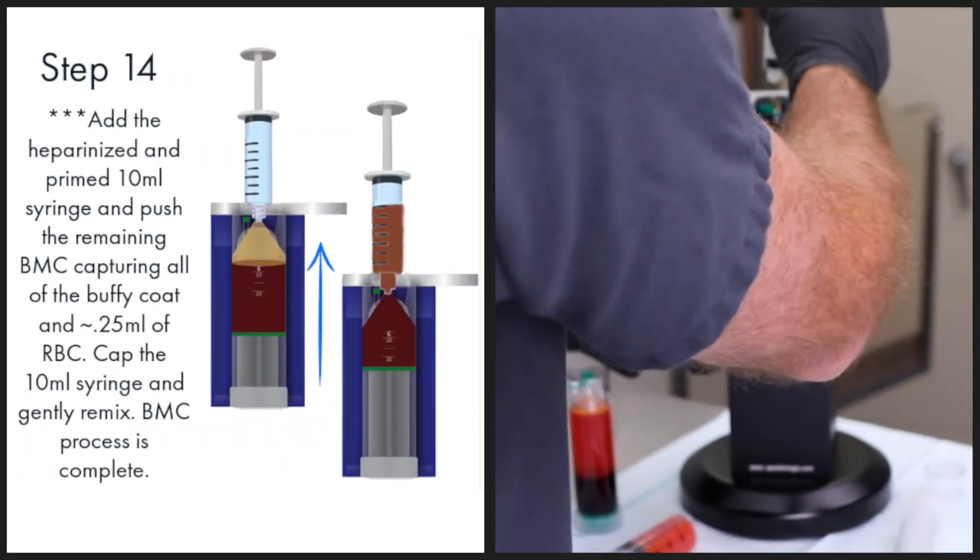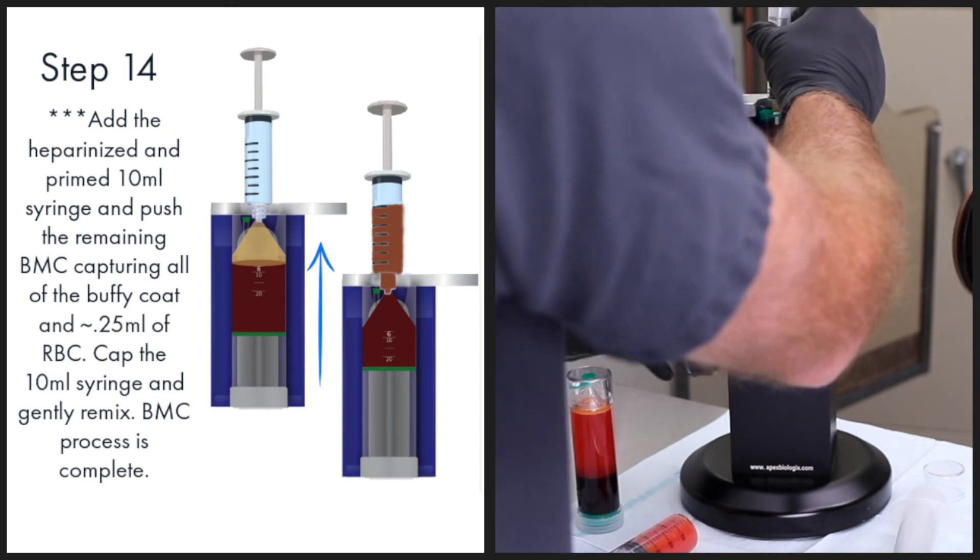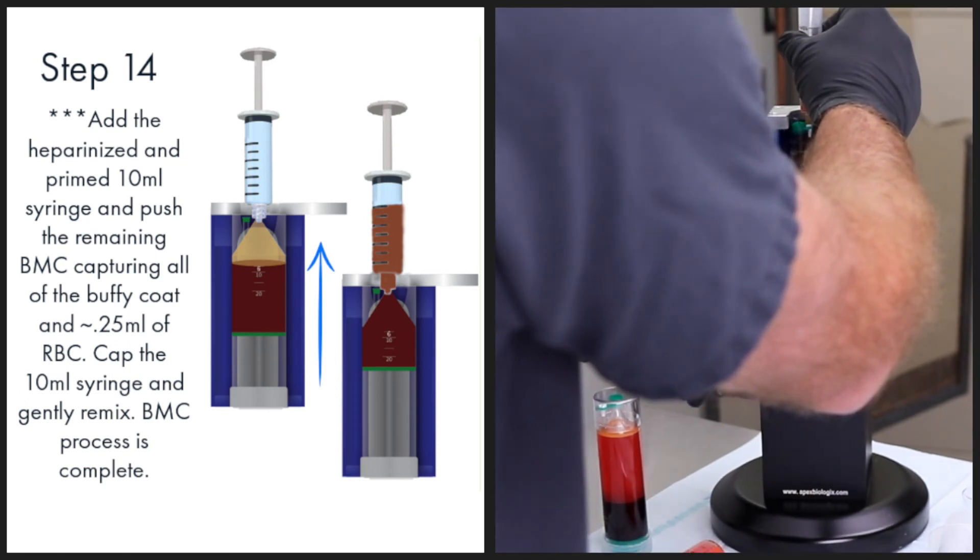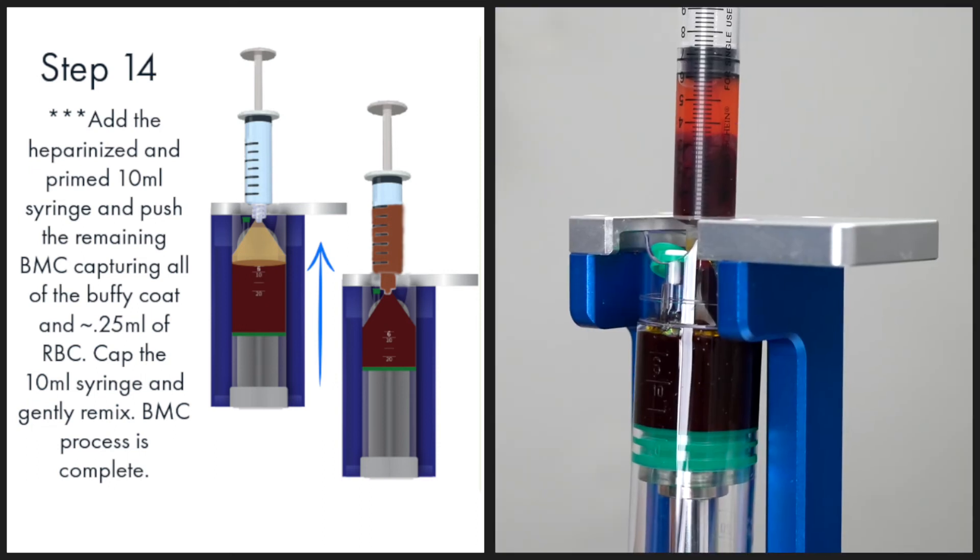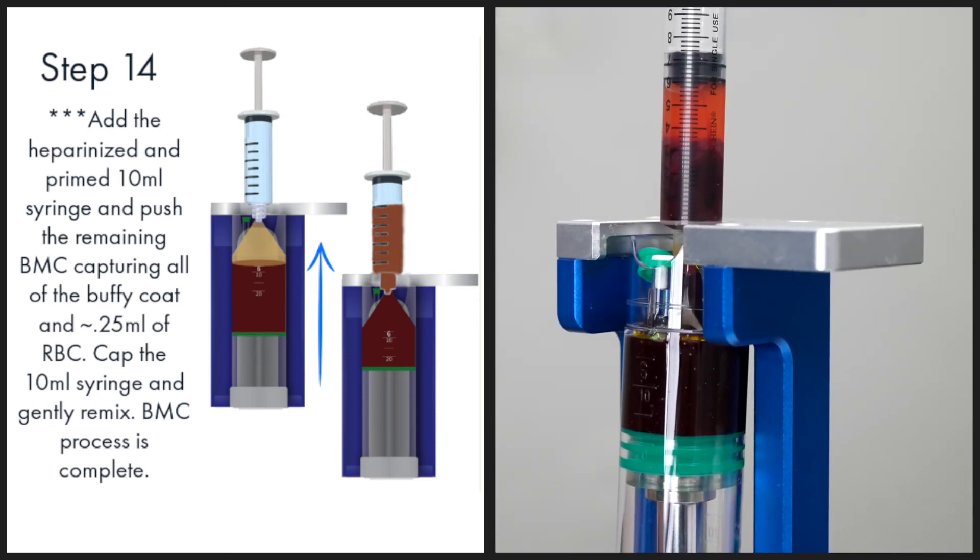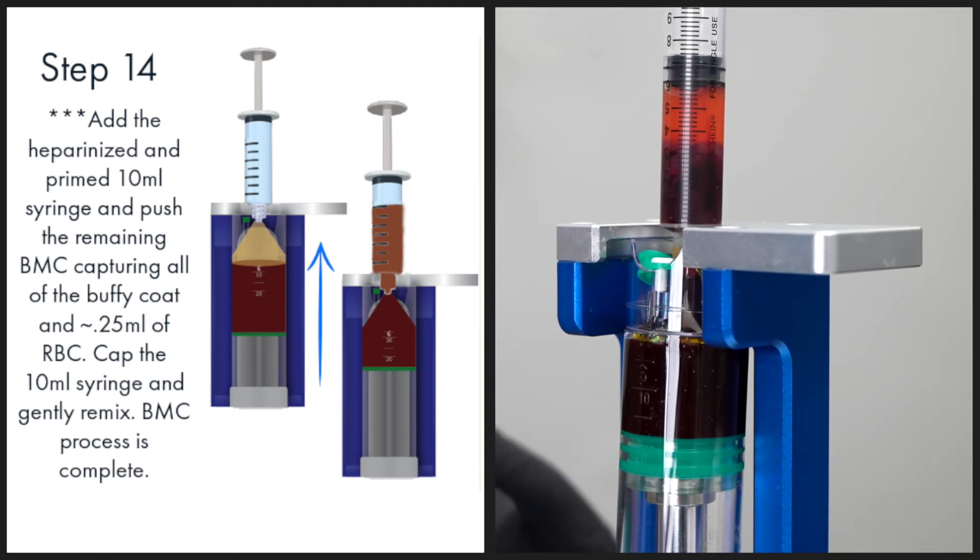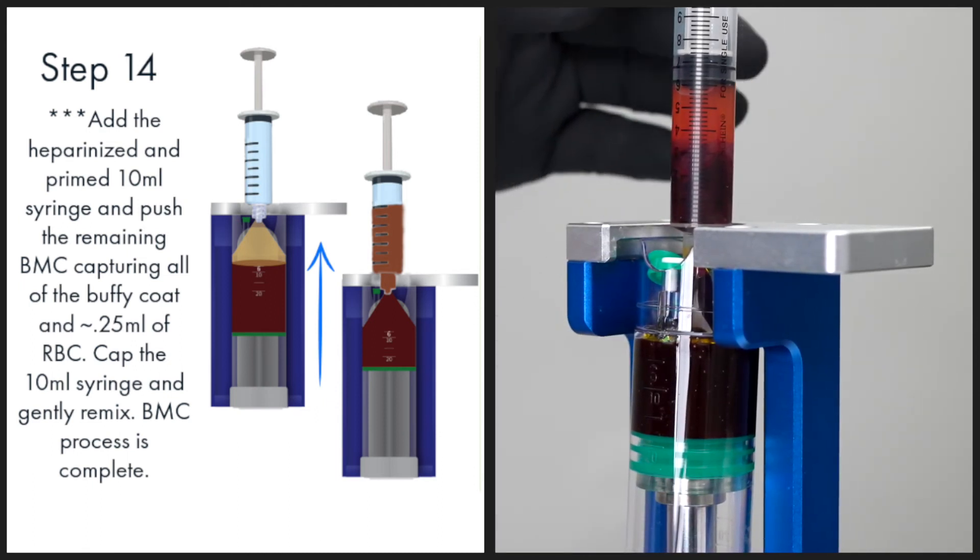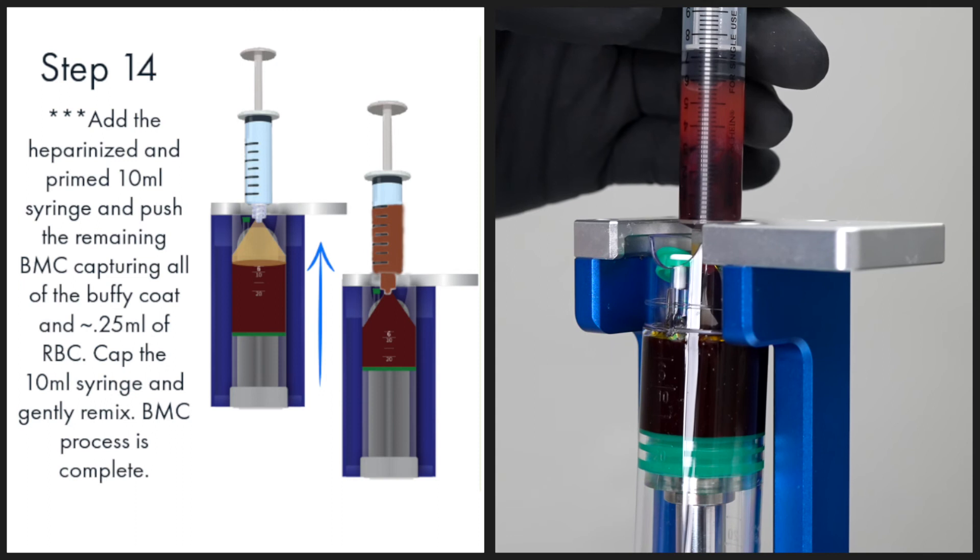Add heparinized and primed 10 milliliter syringe and push the remaining bone marrow concentrate, capturing all of the buffy coat and about 0.25 milliliters of red blood cells. Cap the 10 milliliter syringe and gently remix. The bone marrow concentrate process is complete.